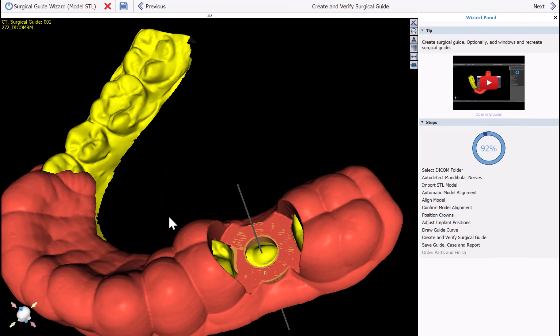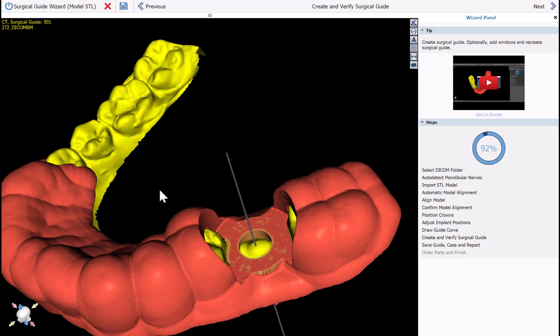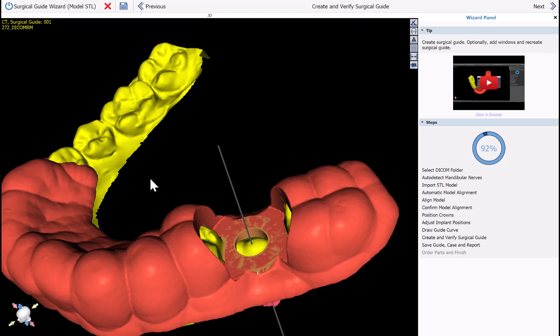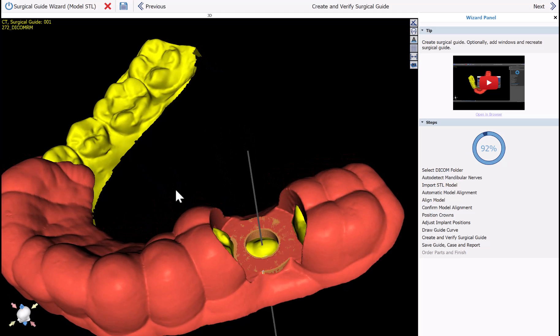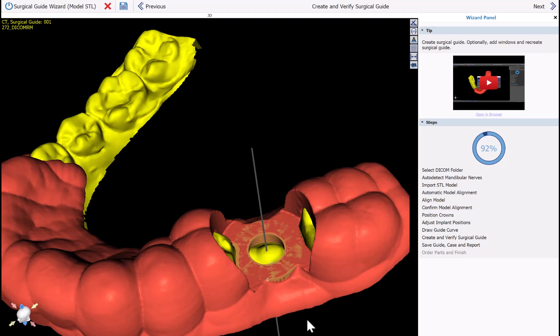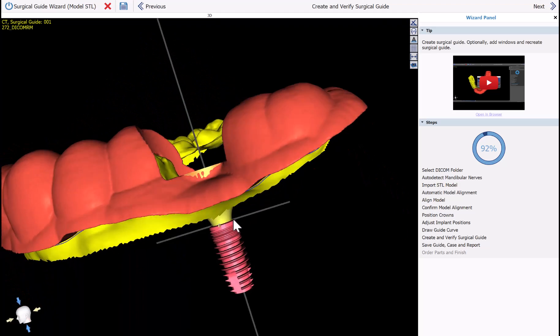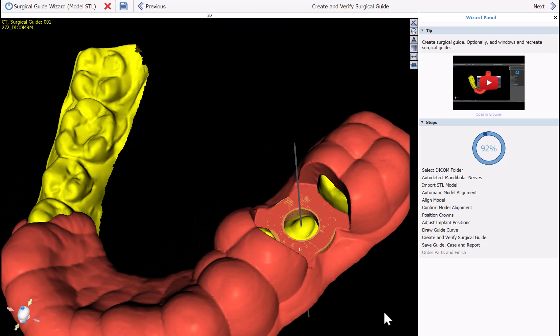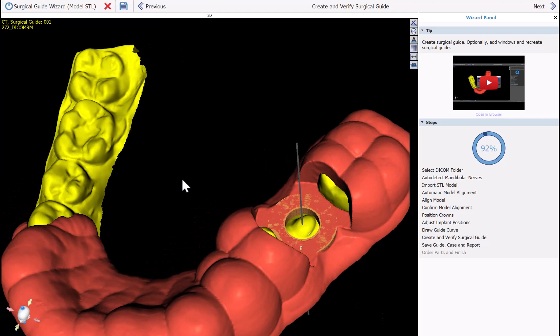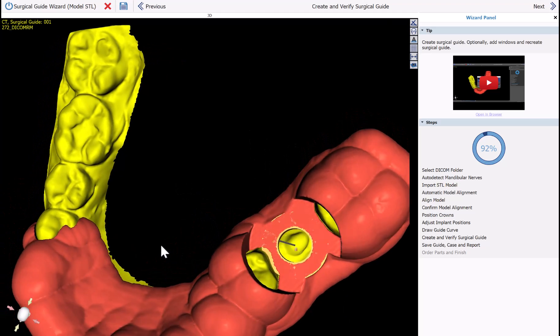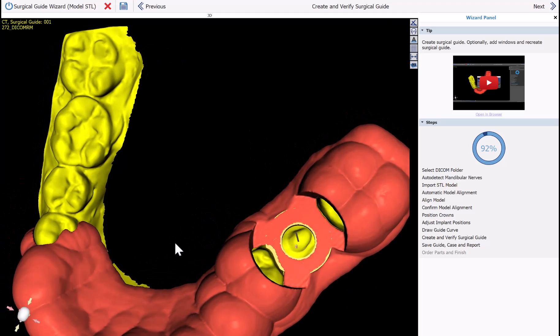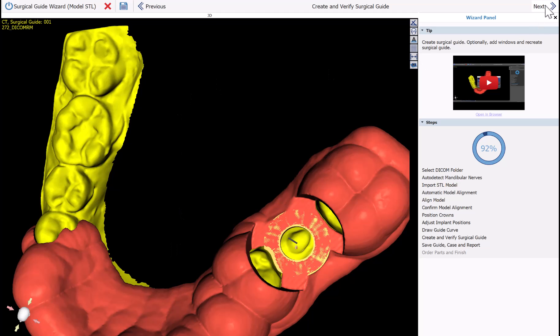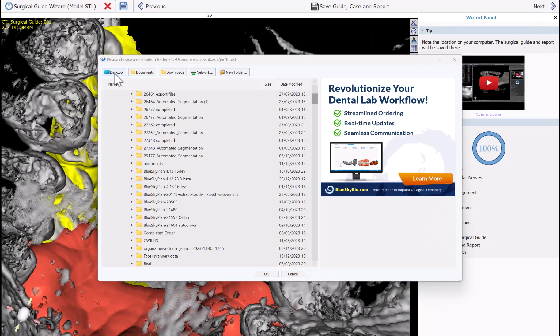We can now see that the surgical guide has been created. The guide tube aligns perfectly with the surgical guide, and the vertical axis of the implant goes through the center of the surgical guide hole and the center of the guide tube. Click Next.